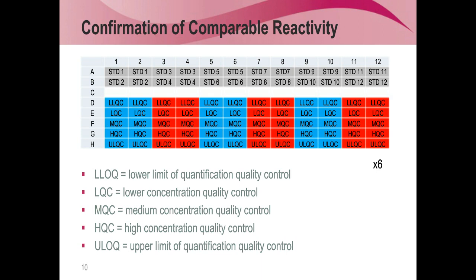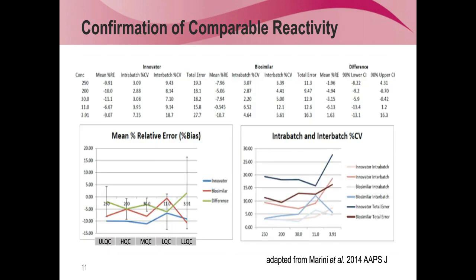And when we have gathered all the data from this one, we are basically analyzing them according also to the AAPS white paper about biosimilars, and these are a lot of numbers and a lot of graphs here. But what is really important is essentially we're looking at the bias between the curves, and we look if this is not above 10% or actually 20%.